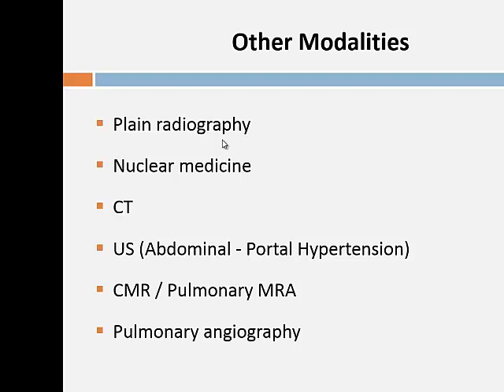There's still an important role for plain radiology, simply because you will often be the first person to notice that the pulmonary artery looks big, and that can trigger a whole line of investigations. It's not uncommon to get a breathless query cause, even a GP film, and you'll notice that the pulmonary artery looks big, and then you'll suggest some further investigations.